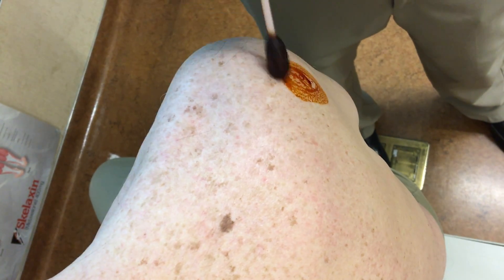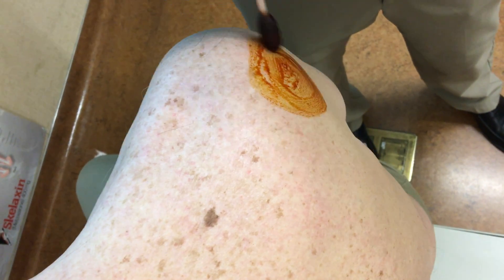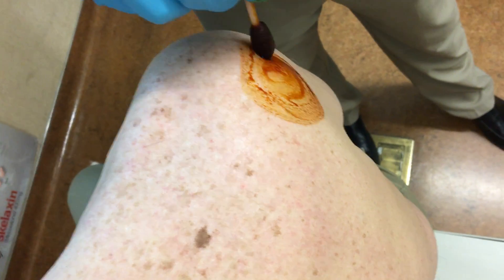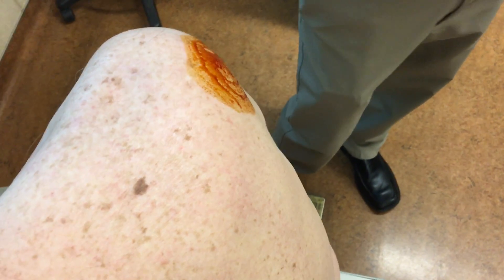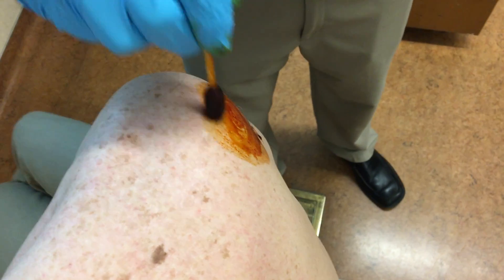So we use a little iodine-based stuff. You haven't had a reaction to iodine, have you? Not yet. All right. From the inside out — get all those bugs out of there. One more time. We do this three times to be super sure. You're moving, you're moving — my circle's horrible now. I don't want to get the betadine on my clothes. Four by fours.